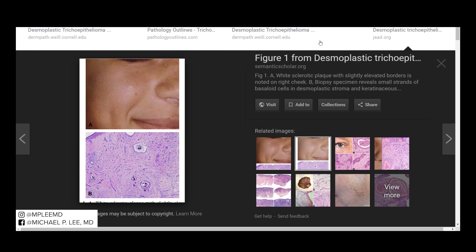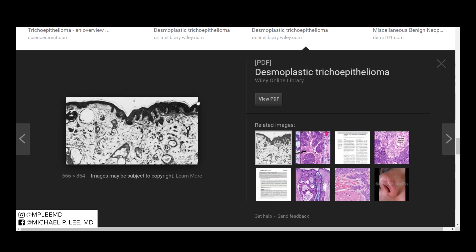It's a firm donut-shaped lesion on a young person's, typically, cheek. You can see here — this was from an article from JAD — that's the lesion right there. Histologically, they describe a central dell or depression within the epidermis, and I believe that's what they're trying to show there, kind of like this central depressed area.